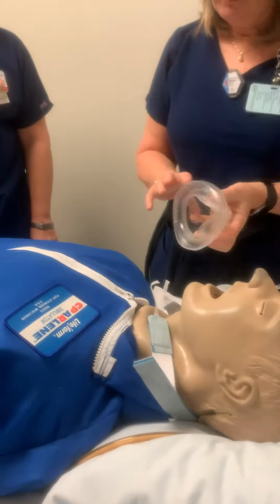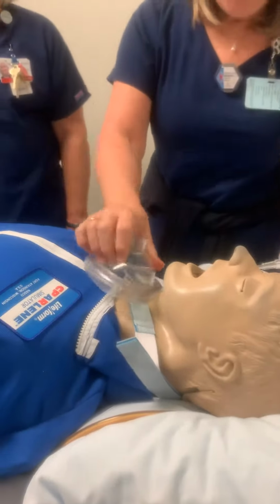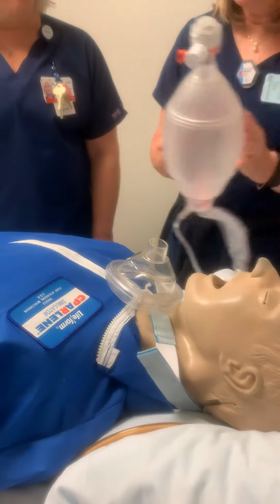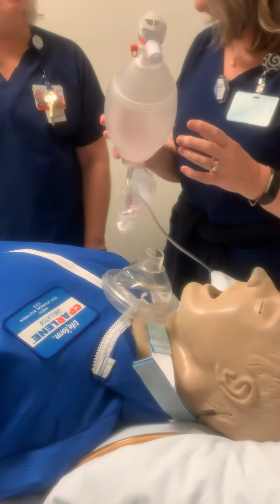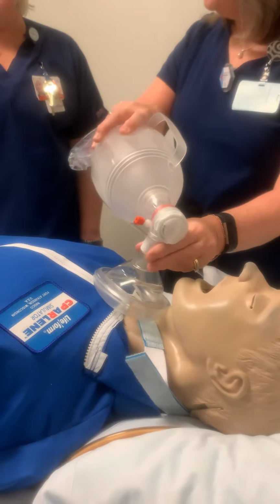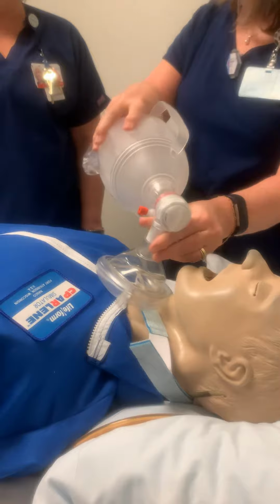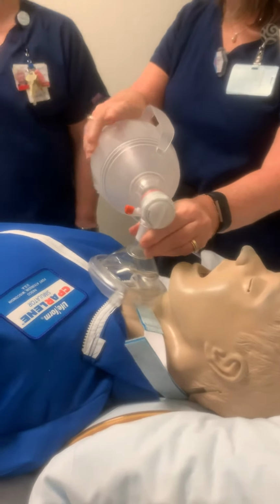Okay, I just don't quite know, that's a pediatric mask. We have one. And then I would have somebody call about having it reinserted. Okay, and who would you call first, though? Who would I call first for that? I might call SWAT.